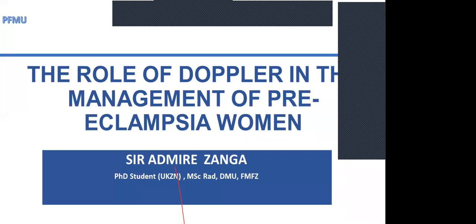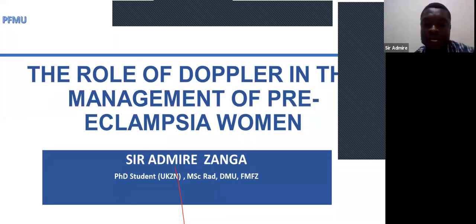Okay. So you mean to say you can do the MCA even at 18, 16 weeks? Oh, all right. In high risk pregnancies, like those flagged for very early onset preeclampsia, we can actually do them even when we are doing the anomaly scan, though they are not really going to determine our decision, because even if we make the decision for delivery, it will not change the care plan. But where it really becomes important, at our fetal medicine unit, is around 27, 28 weeks, whereby we have reached our local age of viability.